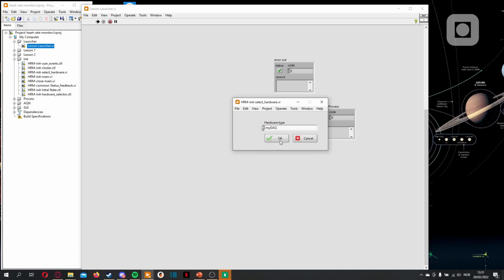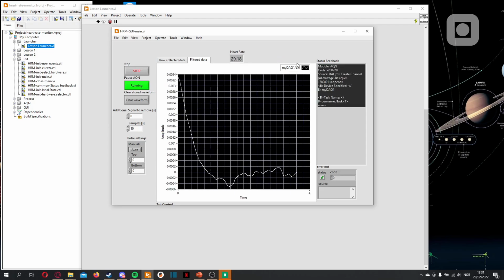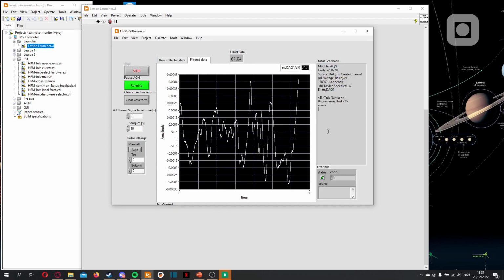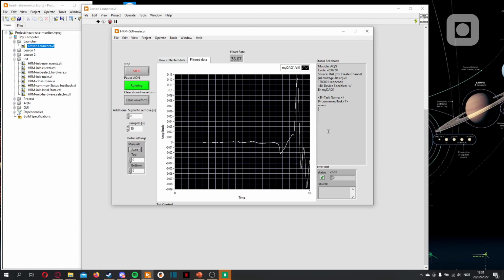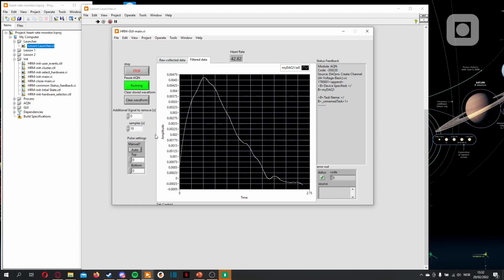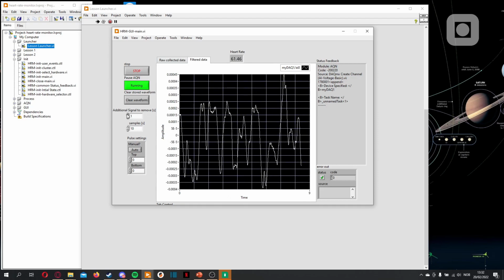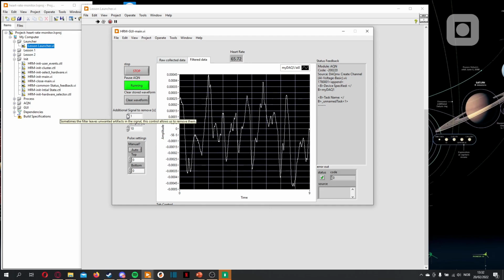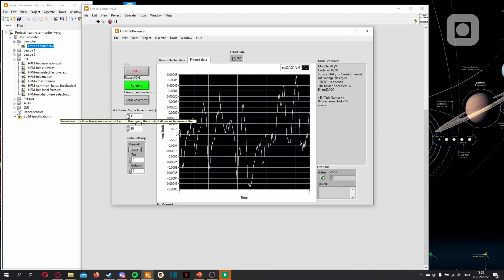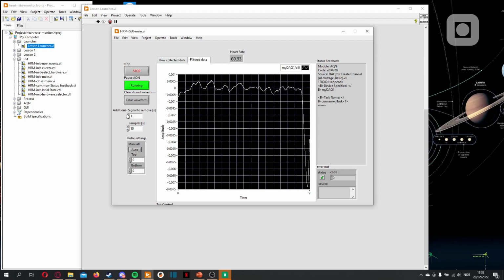Now I've connected my MyDAC, so let's see how this works. We still have the error from last time. We see something is happening. Still moving my finger a lot. I don't have a proper light. Let's clear the waveform so we can start on this one. You see the start problem here. So we'll just move the signal a little bit. I'll try to stay calm, and then maybe increase the light a little bit.